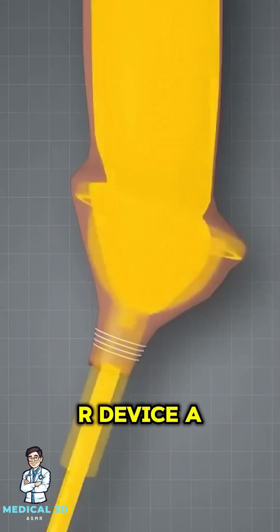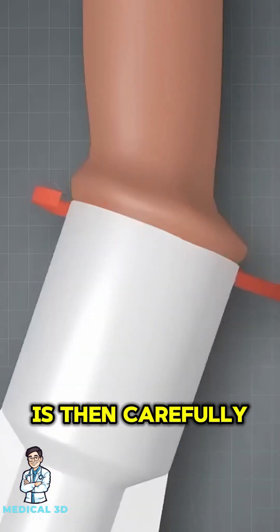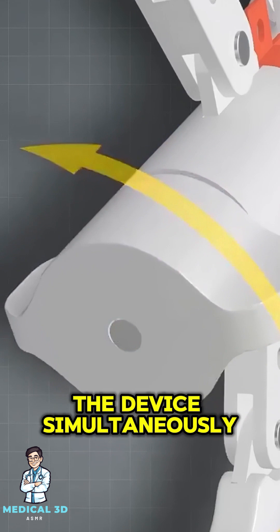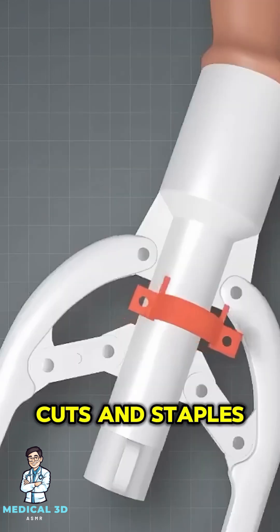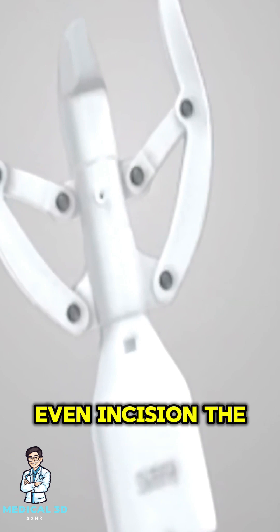The ZSR device, a specialized stapler-like tool, is then carefully positioned around the foreskin. Once aligned, the device simultaneously cuts and staples the foreskin, using a circular blade for a clean, even incision.